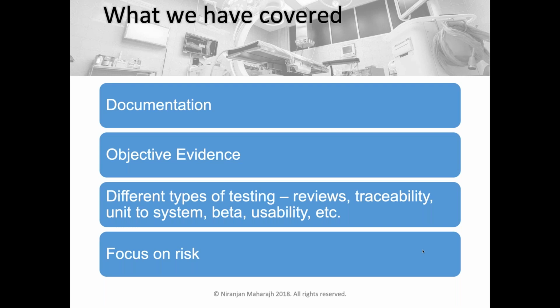So, last summary slide. What does this all mean from a software tester perspective? What this means are the evidence and the documentation. It's not only the work we do as software testing, it's the documented, approved, reviewed artifacts we would normally create in a software testing project. Now it has to be put in that form that lives within the Design History File.